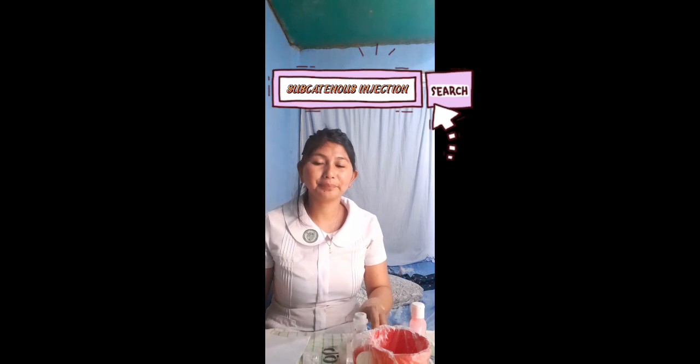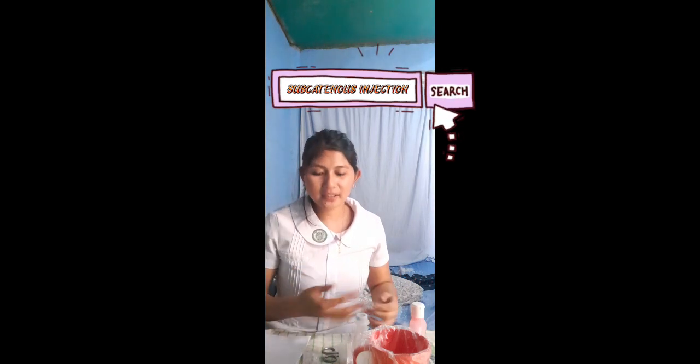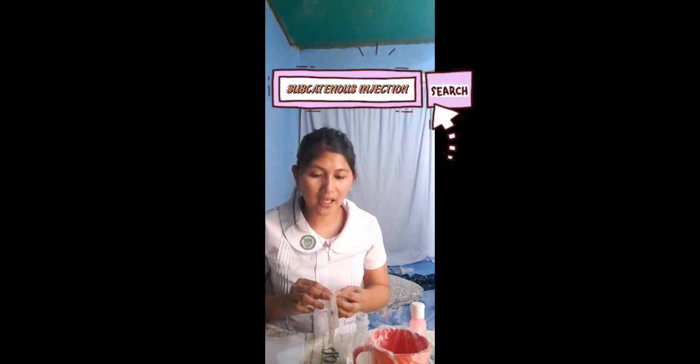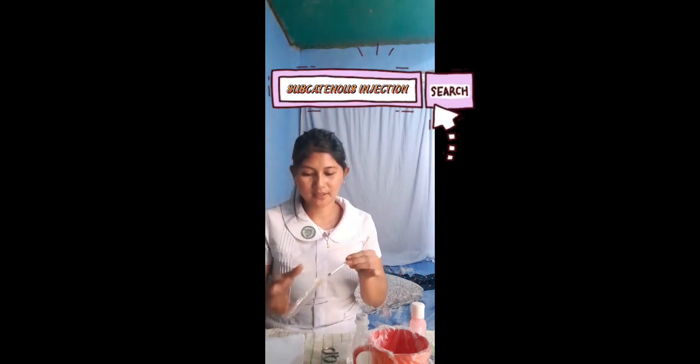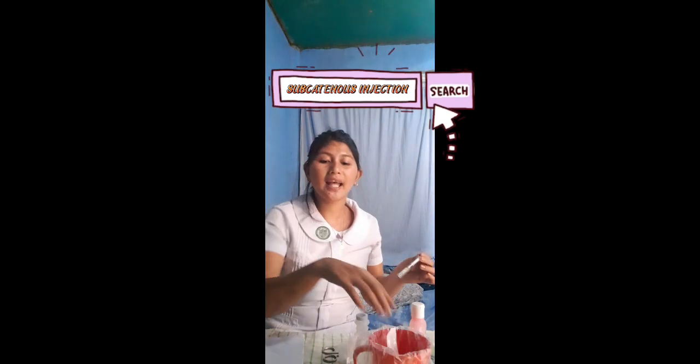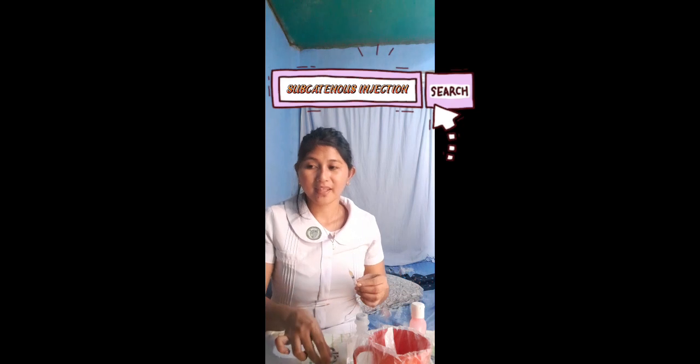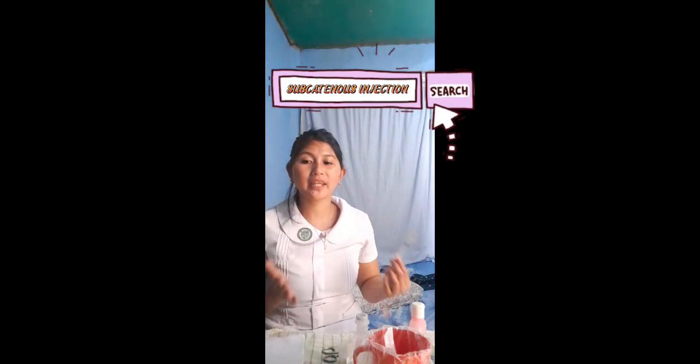Okay, they are the same. Then for the insulin syringe, we need to open the sterile cap, take the syringe out, discard the cap, and uncap the syringe.